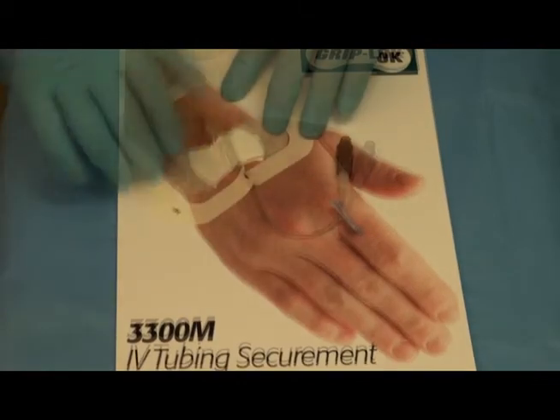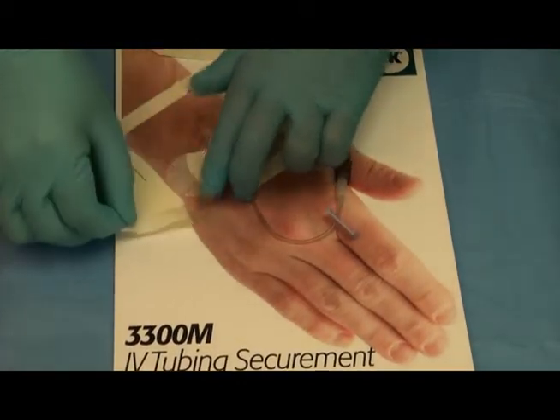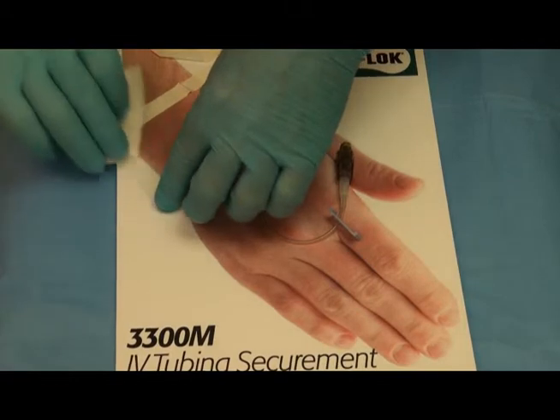Typical application is to apply a transparent dressing to cover the entire site including the Grip Lock.